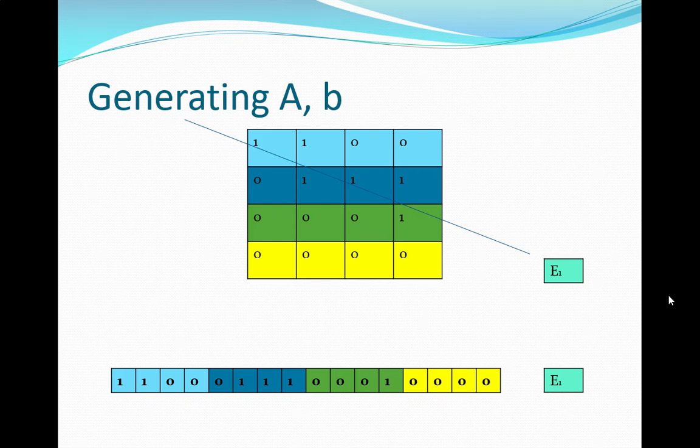If it just nicks the corner, we don't count it, but the average of that whole thing would be somewhere around 0.7. So we will often adjust for it when it's at an angle to give a corrected path length. Again, averaged. Does that feel good?